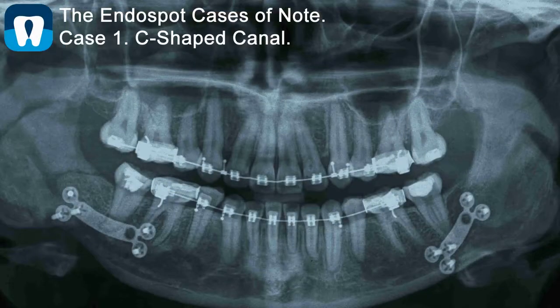And you can see the anatomy in this video. We've got a GP point in the mesiobuccal canal. Preparation isn't quite complete, but you can see as we move that GP point that it's passing underneath the distal canal. So those two canals are merging at that point. The tooth was dressed with calcium hydroxide for 2 weeks. Symptoms were relieved fairly quickly after the preparation appointment.